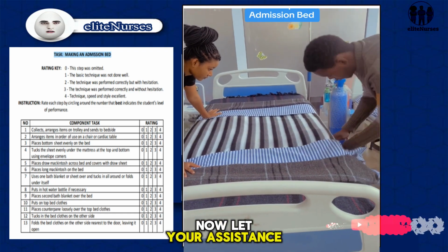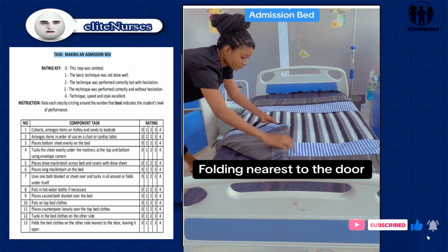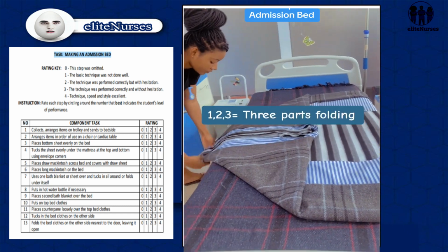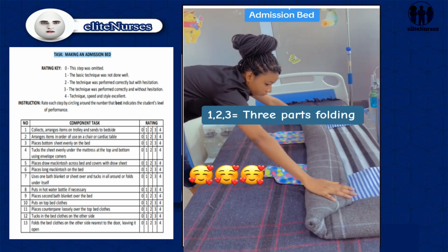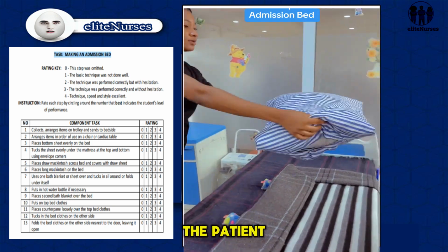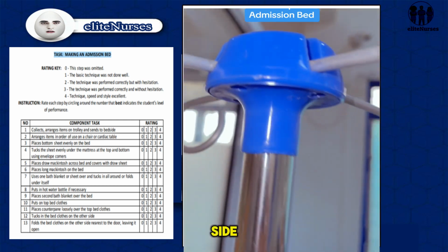Now let your assistant tuck in the bed clothes on the other side. Fold the bed clothes using the 3-part folding technique. 1, 2, 3. Place the pillow on a chair next to the patient. Now raise the bed rails at the other side.